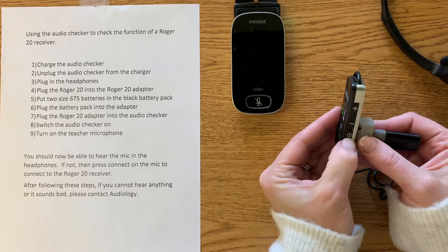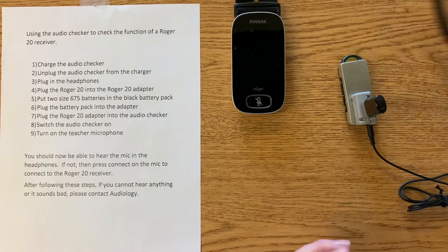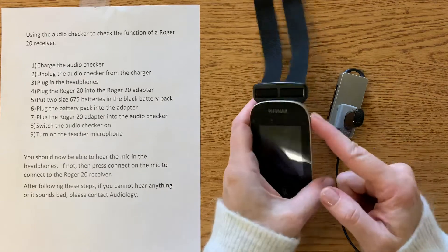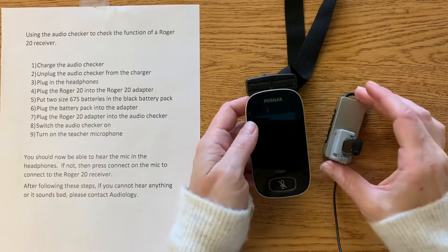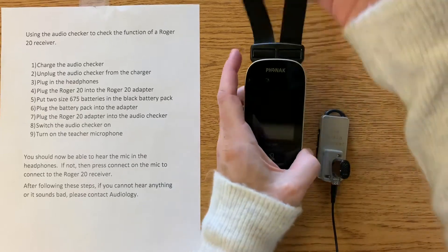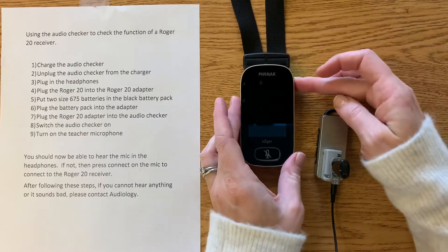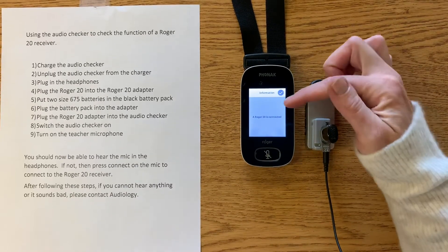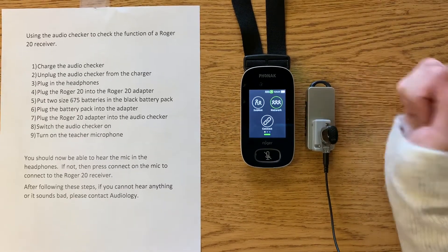Next, we're going to turn on the audio checker and put on the headphones. Grab your teacher microphone — this one's already on. You may hear that little microphone noise when you rub it, or you can give this to someone else to do a better listening check. If you're not hearing it right away, go ahead and press connect to be sure that the microphone and receiver are connected.